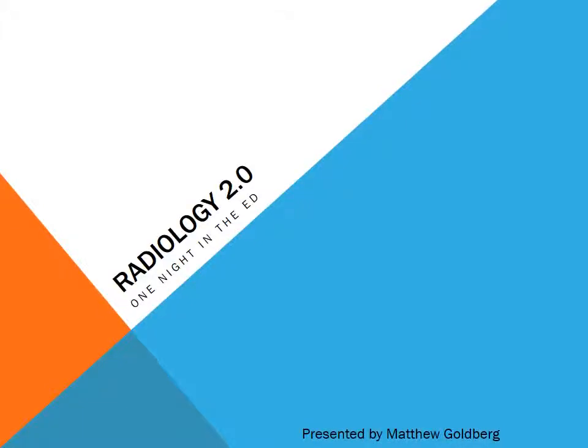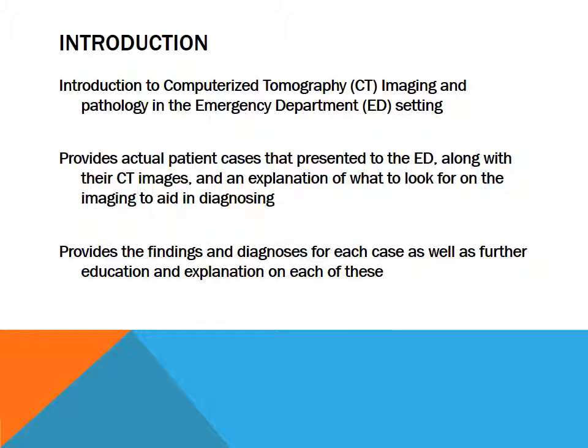This presentation will explore the Radiology 2.0 One Night in the ED application, available for iPhone and Android devices, presented by Matthew Goldberg. This application is designed to aid providers in reading and understanding computerized tomography, or CT, imaging, and its use in diagnosing patients that present to the emergency department, or ED.